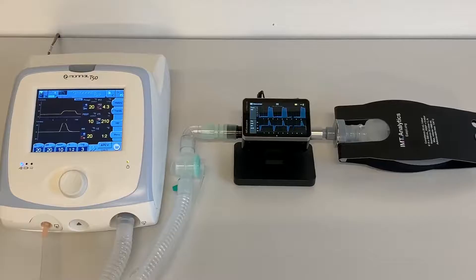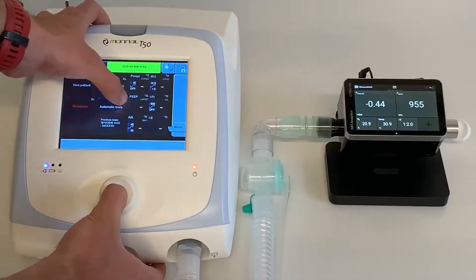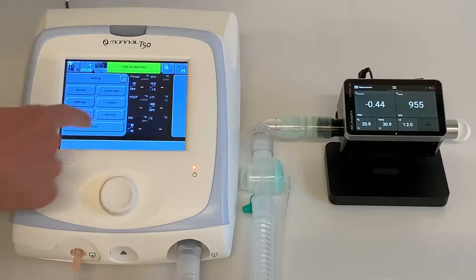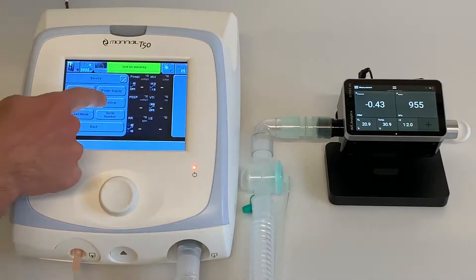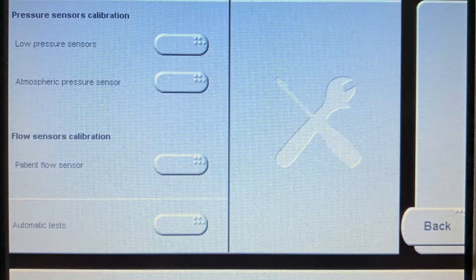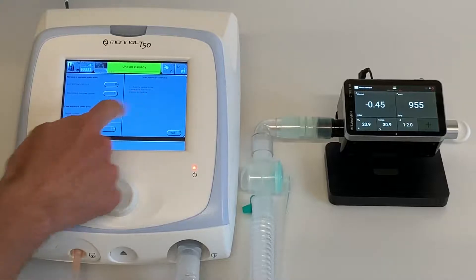The next measurement is pressure sensors calibration. Enter the service screen again and select Service, then select Calibration. Select low pressure sensors under pressure sensors calibration. Follow the instructions on the screen.